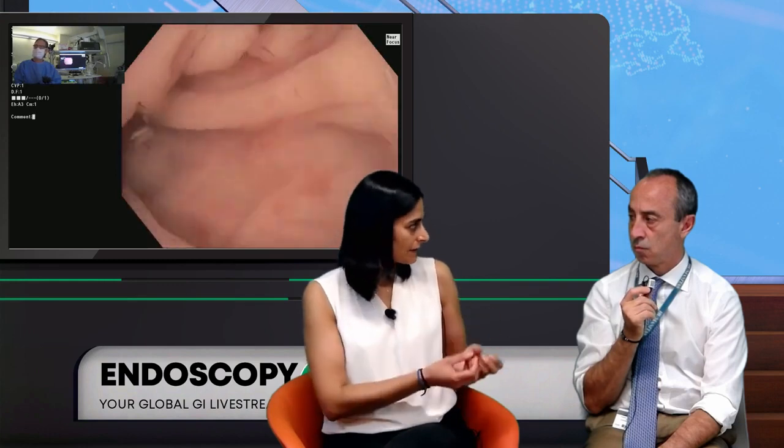Yeah, so I think it works very effectively. It does take some time. It's a little bit tedious because you are keeping the scope in place, as opposed to other necrosectomy techniques where you have to go in, gather the necrosis, and then pull the scope out in order to actually debride and remove tissue. What happens sometimes with other devices is that you can get a good amount of tissue, but it's so attached due to the consistency of the material that by the time you actually come out of the cavity, you have very little material.